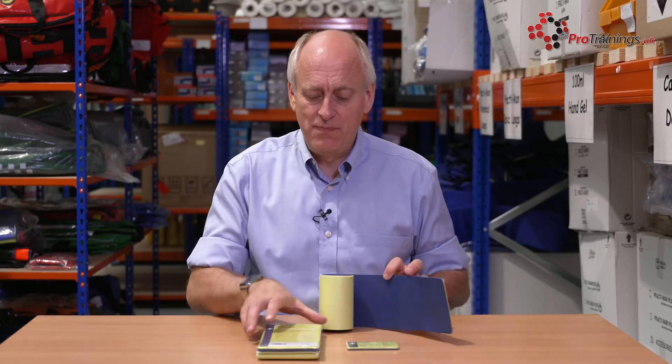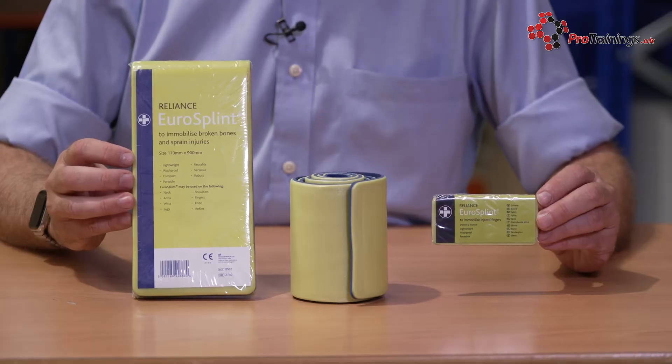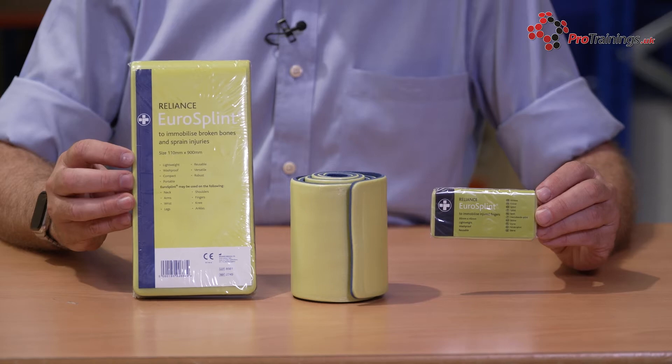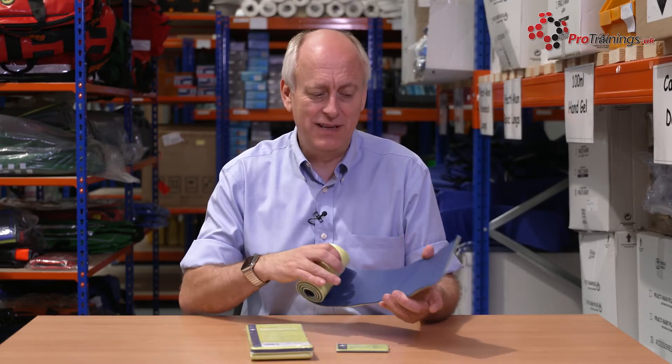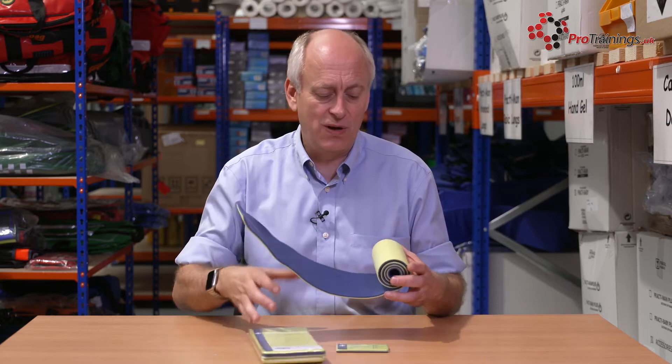It comes in different sizes. This is the roll. There's also a flat pack and a finger version, so you don't need to use the roll for all sizes. Within training, you tend to often use the roll because it's easier to work with in the classroom. But when you're using it for real, you just have one of these in your first aid kit. Sometimes the flat pack's easier to fit into the first aid kit than a roll.